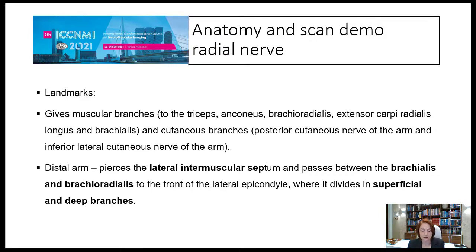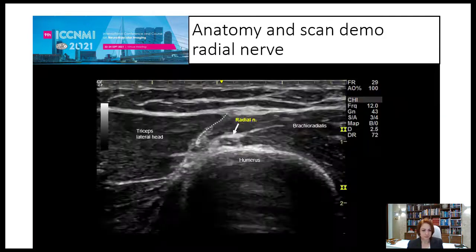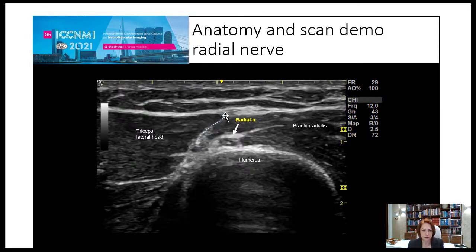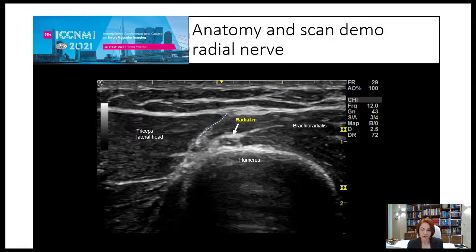In the distal part, the nerve pierces the lateral intermuscular septum and passes between the brachialis and brachioradialis to the front of the lateral epicondyle, where it divides into superficial and deep branches. Here you can see the exact moment when it pierces the lateral intermuscular septum, between the triceps lateral head and the brachioradialis muscle. From this point on, the deep brachial artery separates from the nerve and no longer accompanies it.